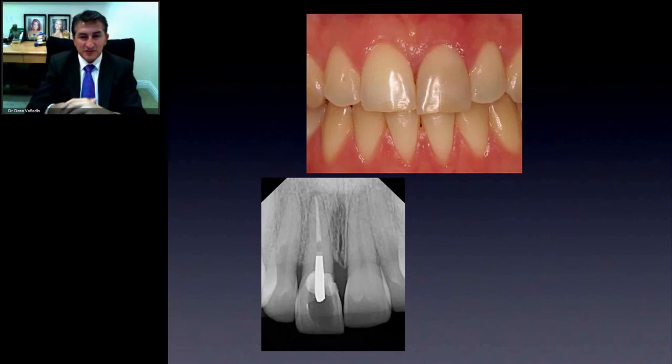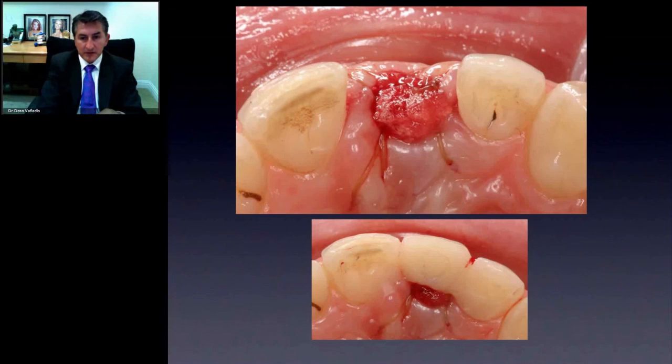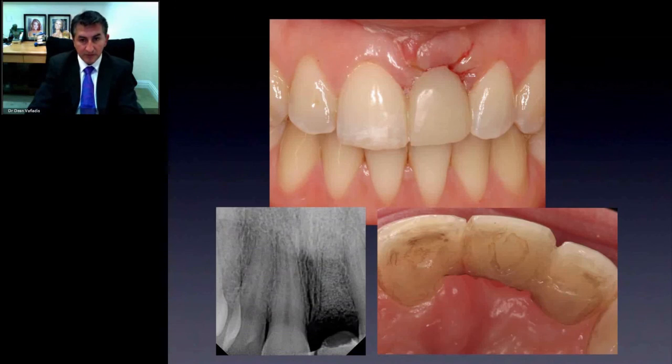Okay, in this patient treatment, a patient had a non-vital tooth that needed to be extracted from recurrent decay and recurrent infection. You can see the fracture is right there. The grafting was done. The tissue grafting was done. A bonded provisional was made again. We like to make the bonded provisionals because they really preserve the tissue and their fixed position. You can see the graft is healing originally, and then slowly it starts healing here.